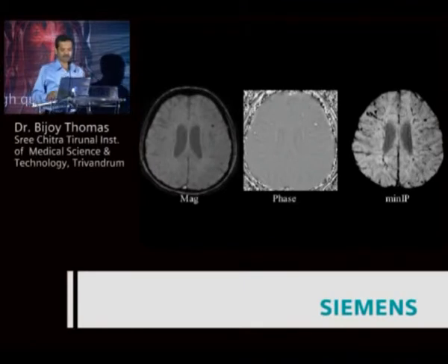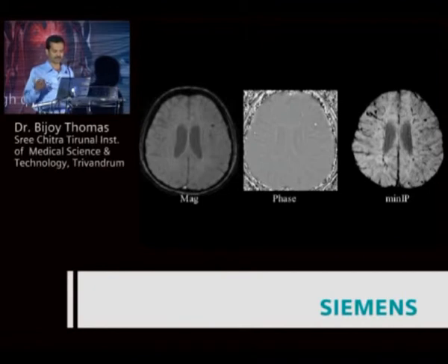So what is this phase? Every MR image has a magnitude and phase. As radiologists, we look at only the magnitude image, and the real and imaginary part of images. If you have phase, you can have useful information. But the reason people were not using it is that phase can produce a lot of errors. That means phase incoherence can come, and you don't get consistent phase averaging or phase results in order to have meaningful interpretation. What they have done in SWI is a unique phase processing.